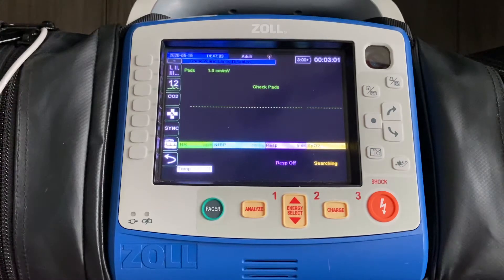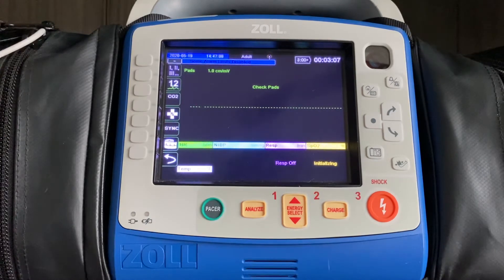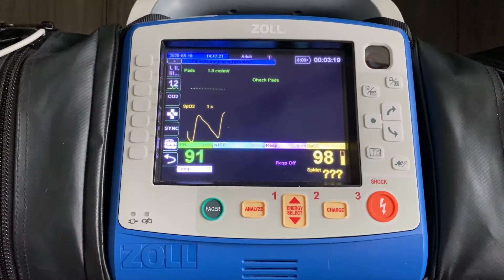Once that's placed on the patient's finger, the monitor will start the search process. You'll see the plethe wave automatically come up on the screen. And then in the bottom right corner, you're going to have your SpO2 value, which takes into account total blood gas saturation in the patient's body.